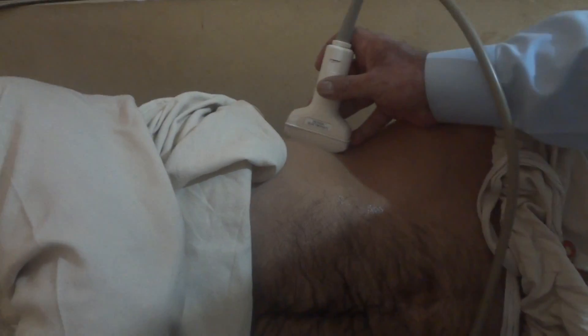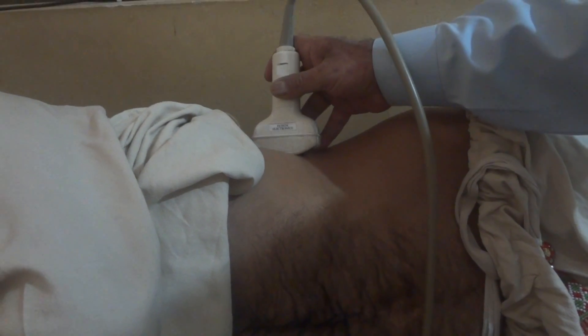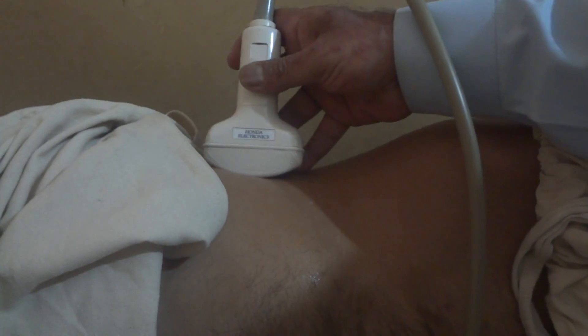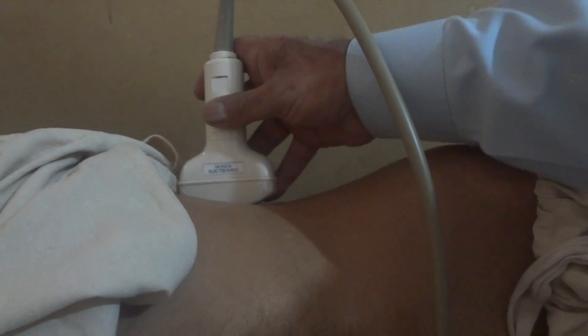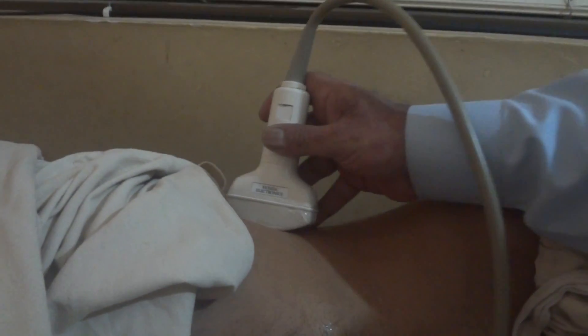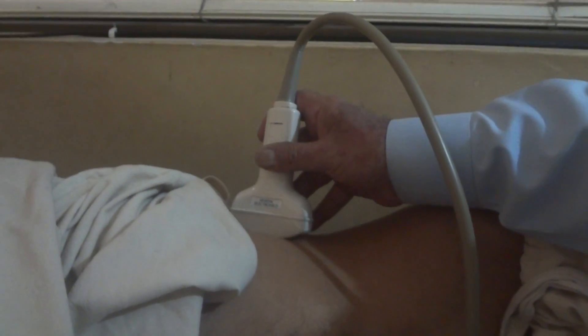To get the full kidney, I may need to maneuver or pivot the probe in this direction, or go one intercostal space backwards. This is the area where you work up — you maneuver and pivot the probe angle to get the whole kidney visible. So this will be our scanning plan and patient position.